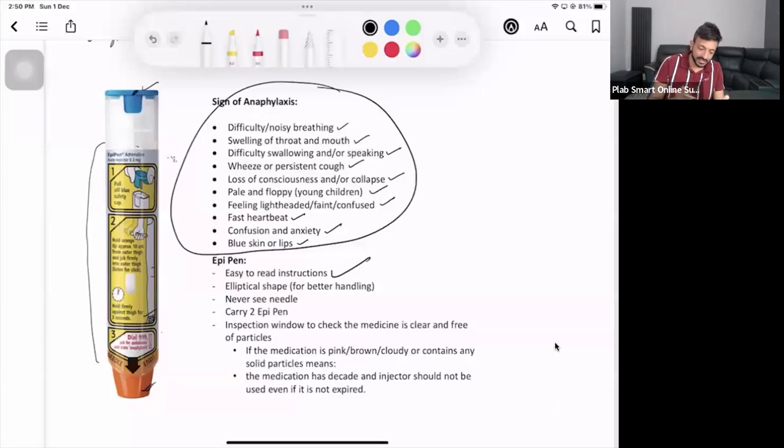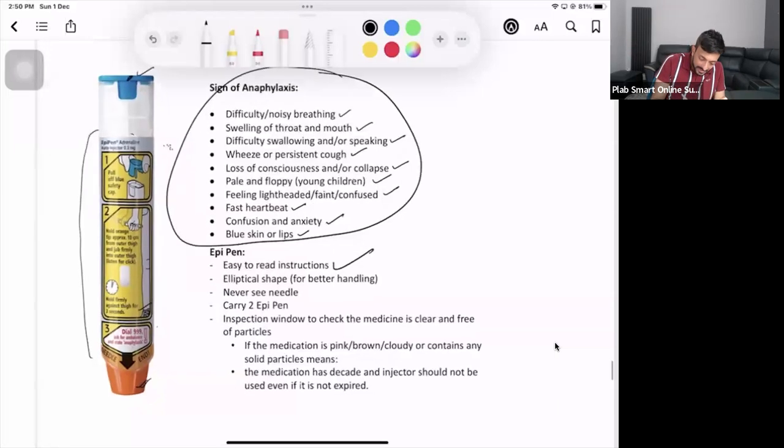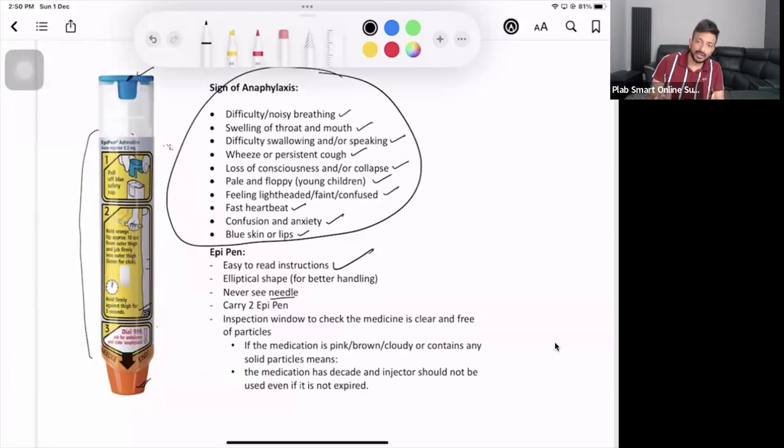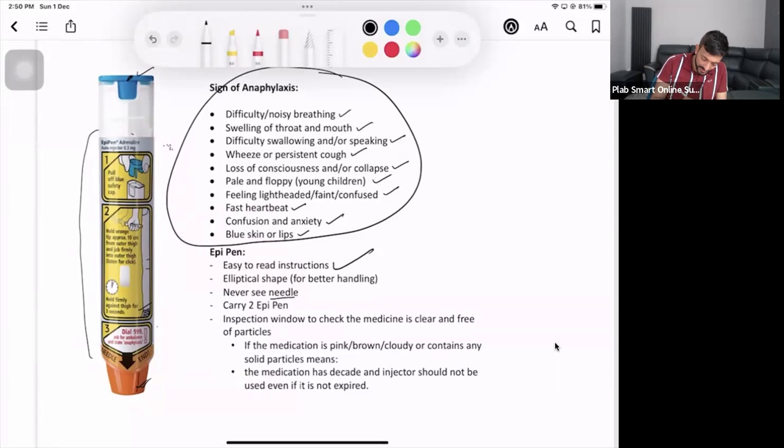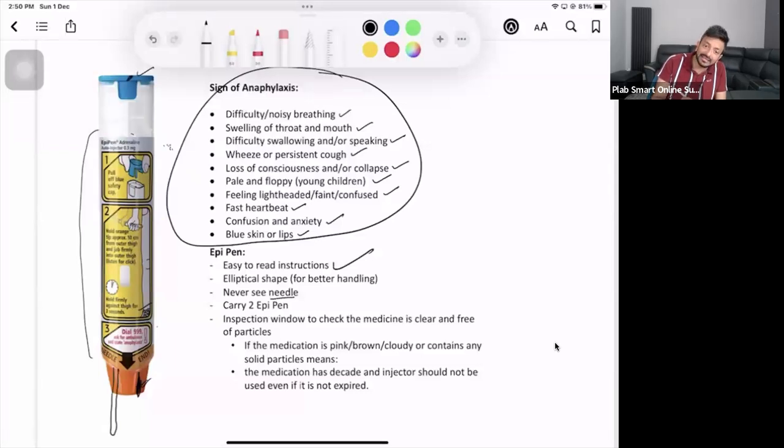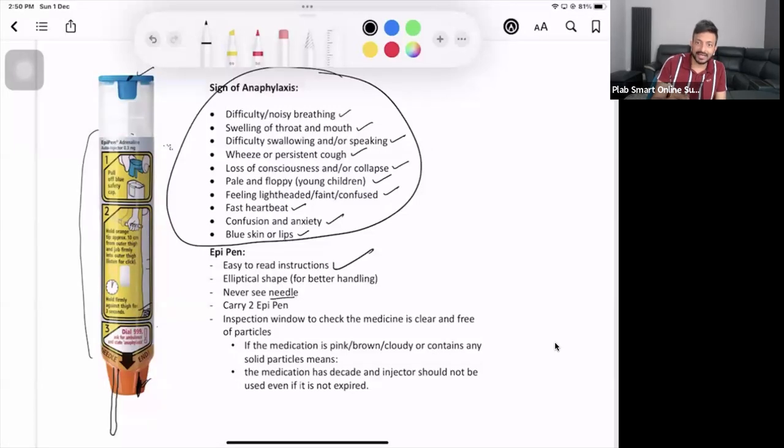You never see the needle. The thing is this is one-time use only. When you use it, this orange thing, now you can just see this much orange, but when you inject it you will see this orange lid is going to be coming out, so it's going to increase in size and cover the needle. That's why you will never see the needle. It's for the safety mechanism.